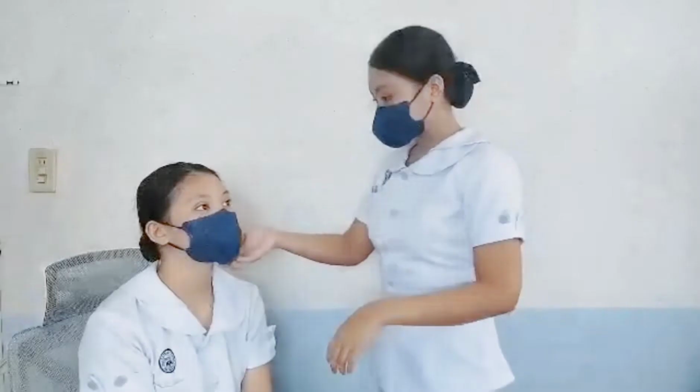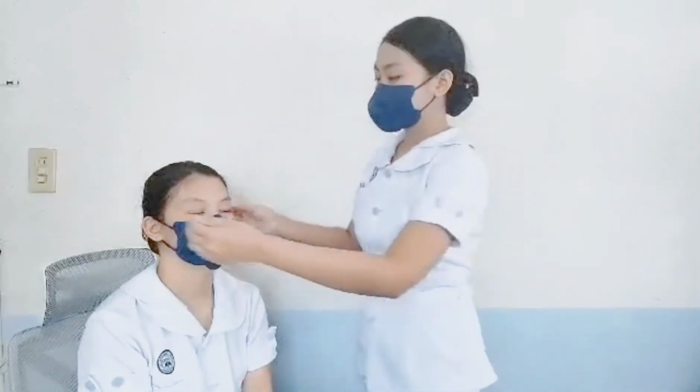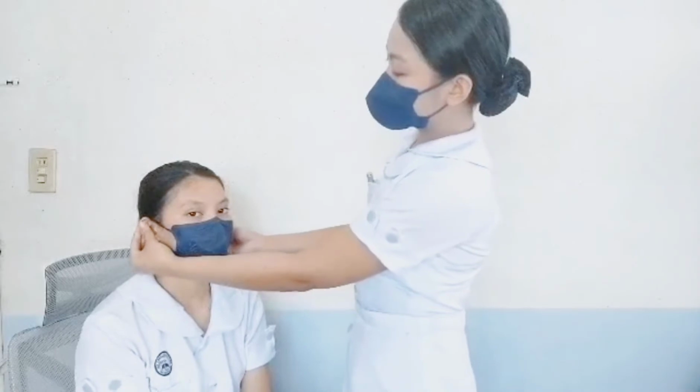So first is we have to inspect the auricles for color, symmetry, size, and position. Next is we have to palpate the auricle for texture, elasticity, and areas of tenderness. Using the otoscope, inspect the external ear canal for cerumen, skin lesions, pus, and blood. Also, inspect the tympanic membrane for color and gloss.